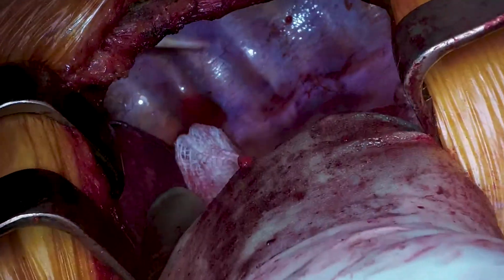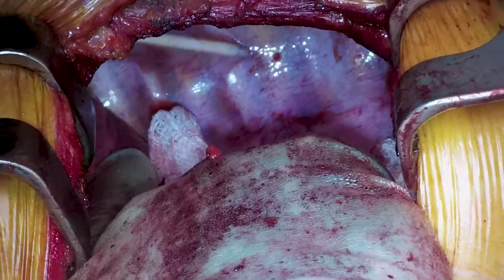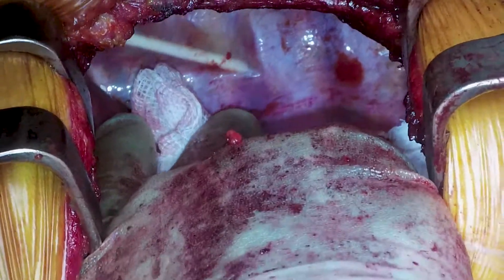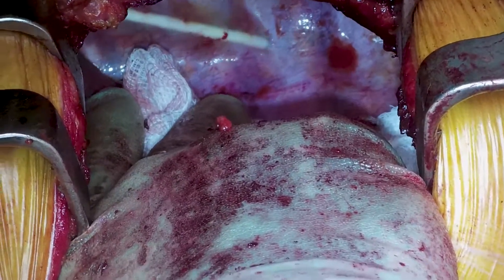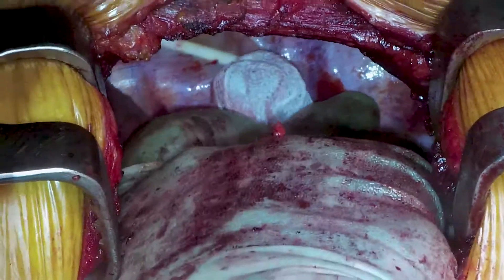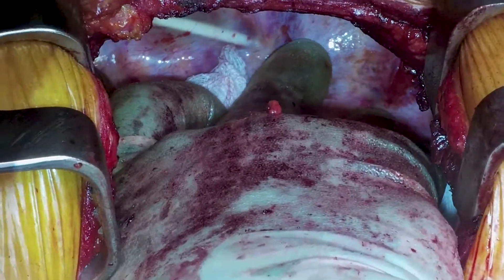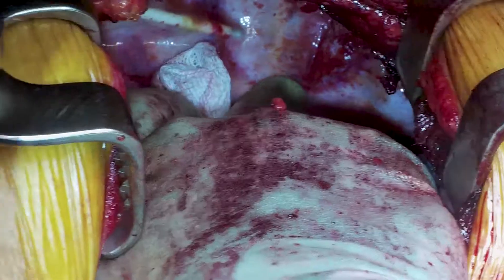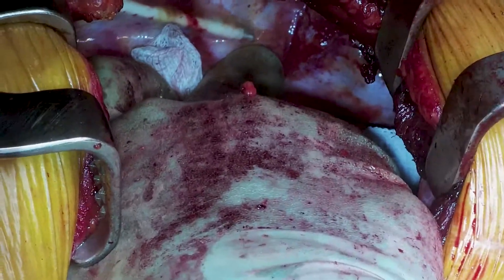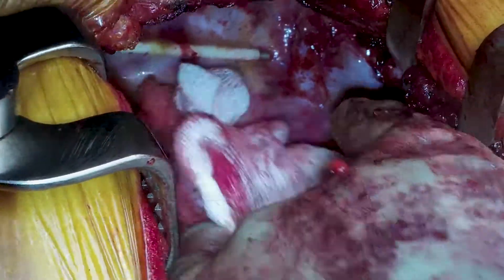We're trying to keep the OnQ tunneller under the pleura the entire way. If you do breach the pleura, you can use Evicel glue to seal it back, otherwise the local anaesthetic infusion will spill into the thorax. Using a gentle rubbing and turning motion to place the catheter, with the incision at about the 8th or 9th space, we're trying to reach as close as the 2nd or 3rd rib — giving a long infusion of local anaesthetic from the 2nd to the 8th rib for continuous post-operative pain relief.